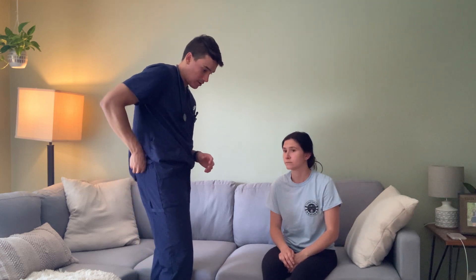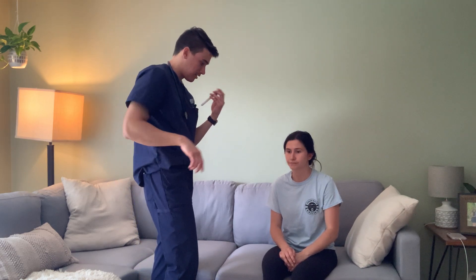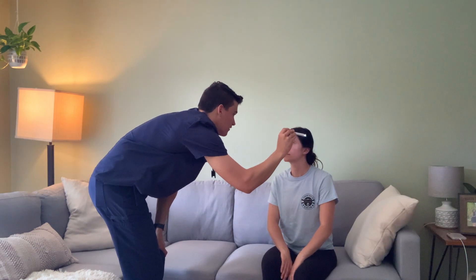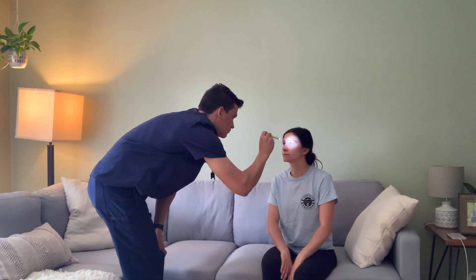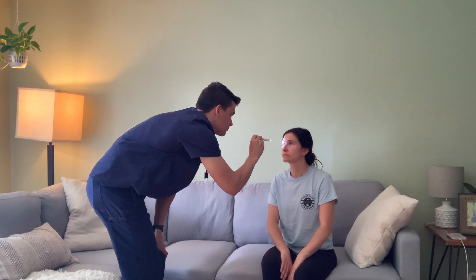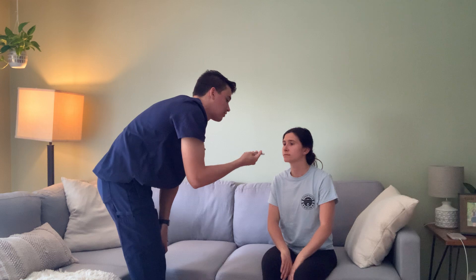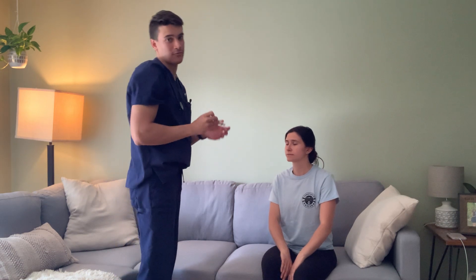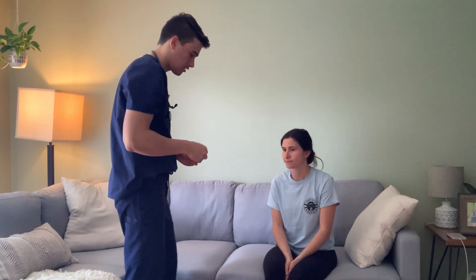Next we're going to be doing a pupils assessment. I have a pen right here, and you're going to look right at me. I'm going to shine this over your left eye. Just look straight at the pen. Pupils are equal, round, and reactive, and accommodating to light as well. So your neurological assessment checks out.